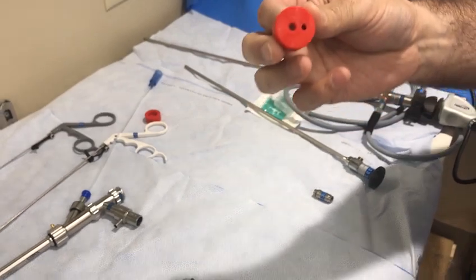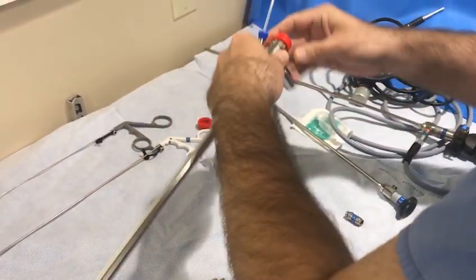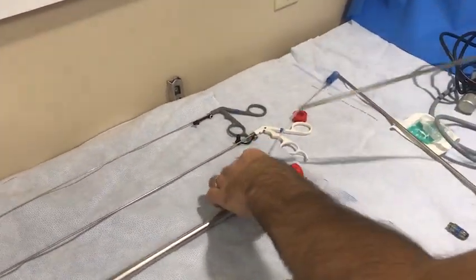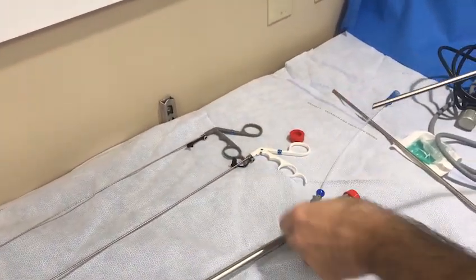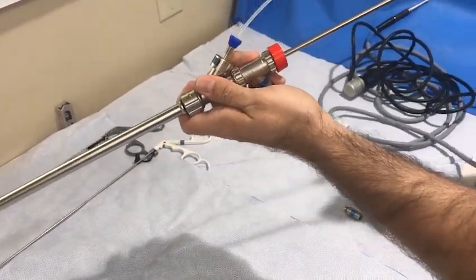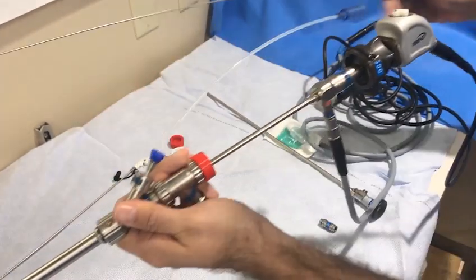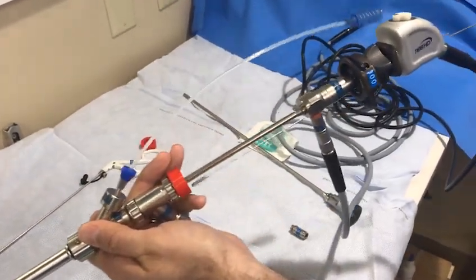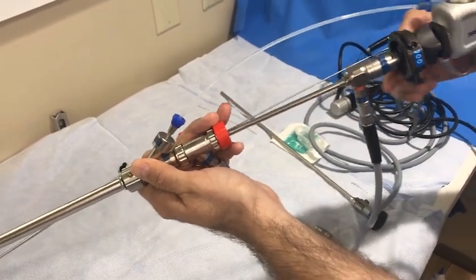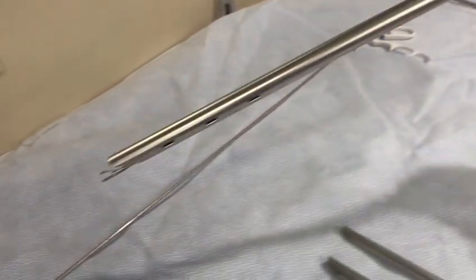If you are using a closed system, choose the silicone red cap that has two holes, allowing for both the telescope and forceps to be passed into the bronchoscope. This is the entire assembly for a closed system: suction catheter, telescope, and gray-handle forceps.